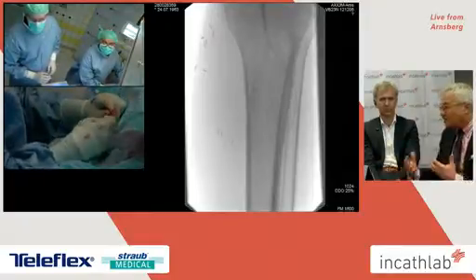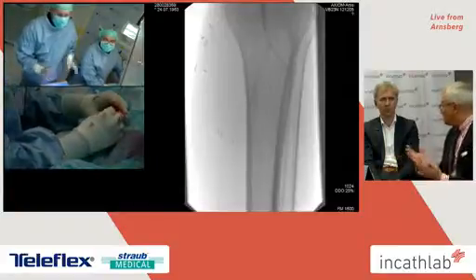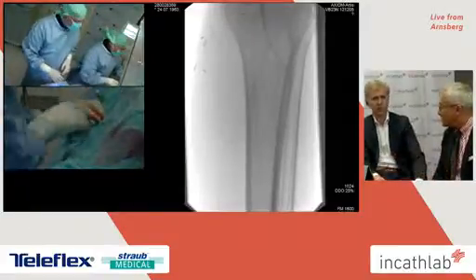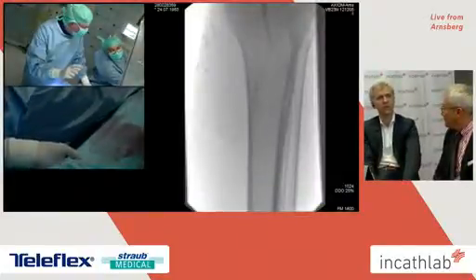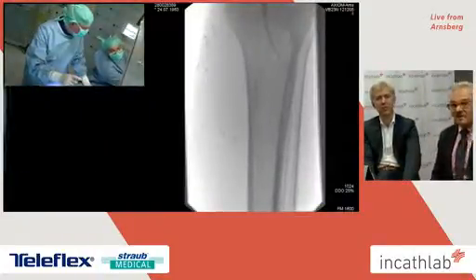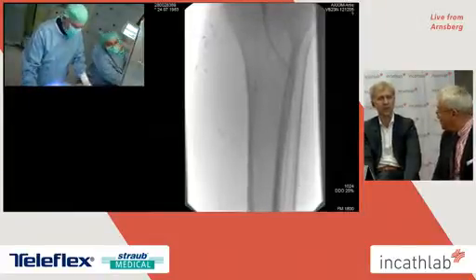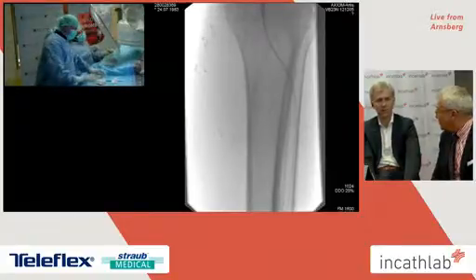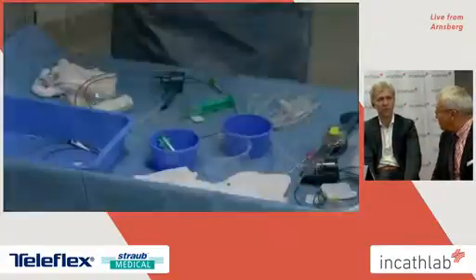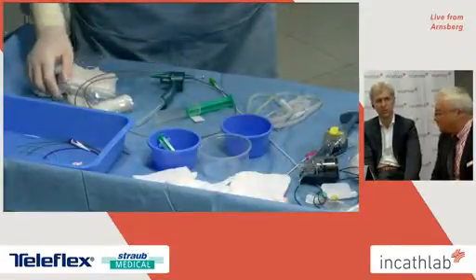Definitely. It's just to discuss the pros and cons of the two different approaches. So sometimes if we face an embolization, we go for a second puncturing. We would just leave the crossover access and then go for an antegrade access if we feel that we need a larger sheath, or that a monorail aspiration system like Diver or Eliminate would not be efficient. We would go for antegrade puncturing additionally.